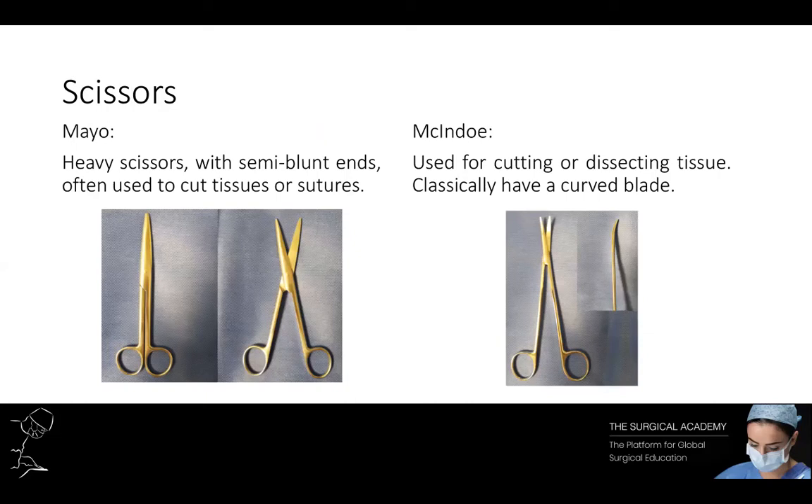Moving on to scissors. There are two main types of scissors. Mayo scissors are heavy scissors with semi-blunt ends, often used to cut thick tissues or sutures. They may be straight or curved. Metzenbaum scissors are often used when cutting or dissecting tissue and typically have a curved blade.